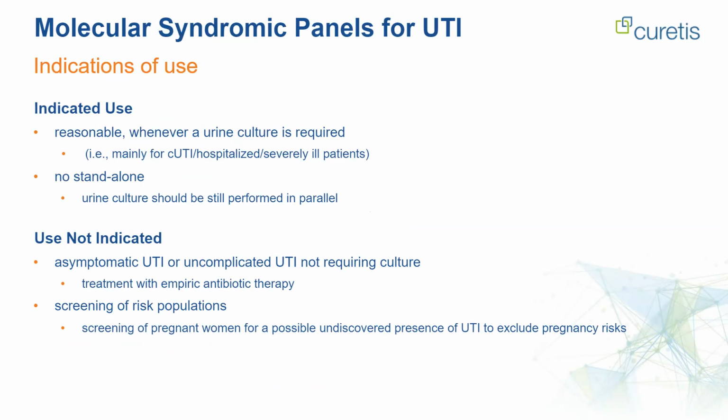This next slide shows you the indications of use. So when to use a molecular panel, when it is indicated. In general, always whenever we would also order a culture. So this is mainly for the cUTI, hospitalized, severely ill patients. A molecular panel would aid in the diagnosis, but it's not a standalone method. Culture should always be performed in parallel.